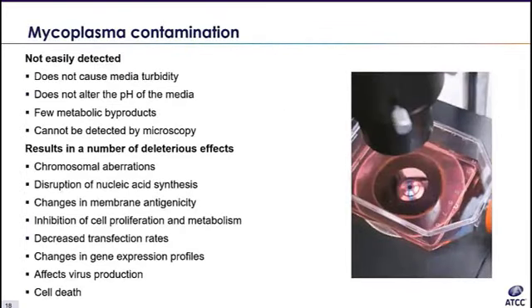So mycoplasma contamination is a separate contamination issue that is extremely difficult to detect. Contamination from mycoplasma can cause a host of problems that includes altering the cell's function, growth, and morphology, causing chromosomal aberrations, affecting nucleic acid synthesis, and changing membrane antigens and gene expression. The main source of mycoplasma contamination is receiving infected cultures from other research laboratories. Reagents purchased commercially can also be a source of contamination.